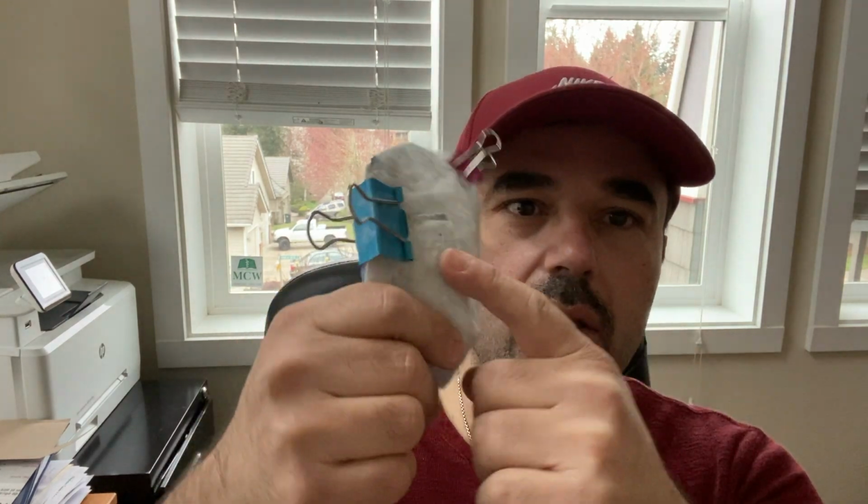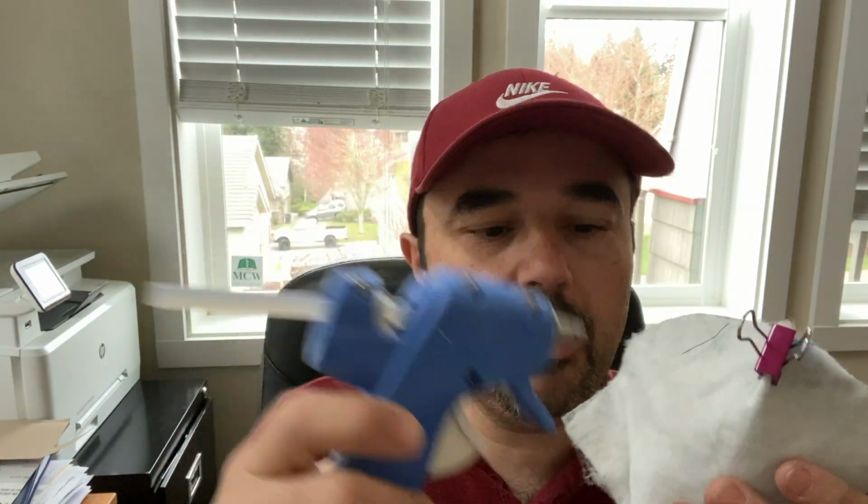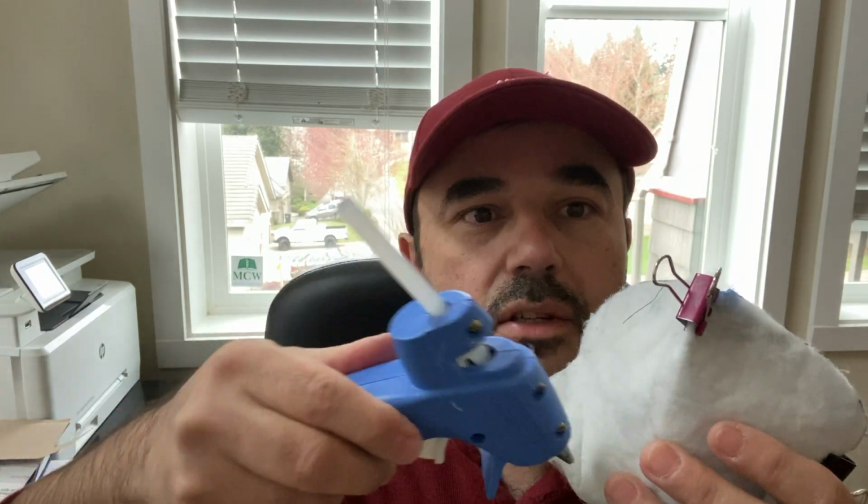And so the very first thing that I would recommend is, starting on one side, leave the nose piece till the very end. I'll show you what we'll do there. Starting on one side, open up the inside here, and what you want to do is start gluing that. And don't touch the metal part to the fabric, because it will stick to it. You just want to lay a rim of glue at the crease and then also along the edge. And be careful with this. Don't put too much glue. You just want to hold it in place in the beginning.